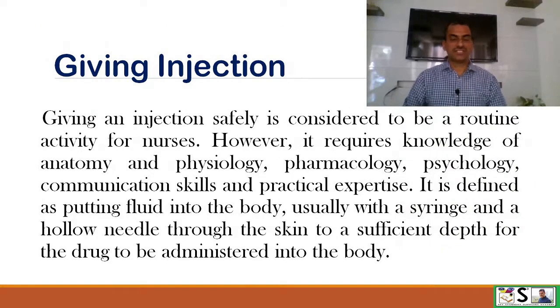Giving an injection safely is considered to be a routine activity for nurses. However, it requires knowledge of anatomy and physiology, pharmacology, psychology, communication skills, and practical expertise. It is defined as putting a fluid into the body, usually with a syringe and a hollow needle, through the skin to a sufficient depth for the drug to be administered into the body.